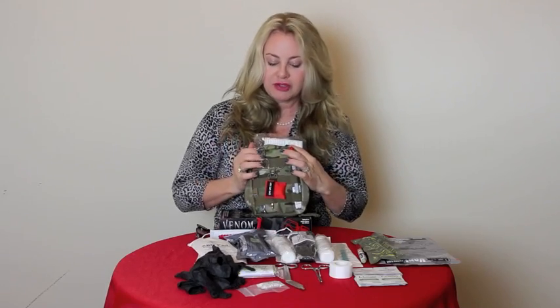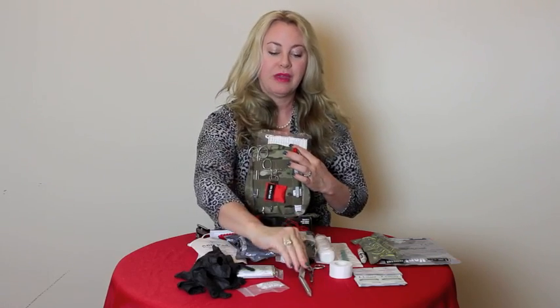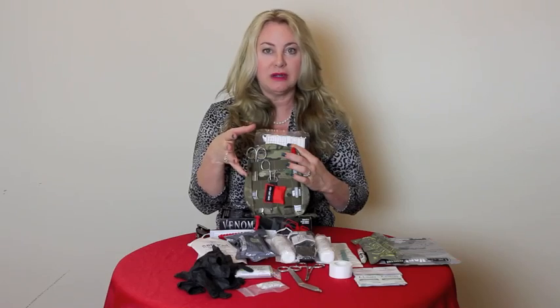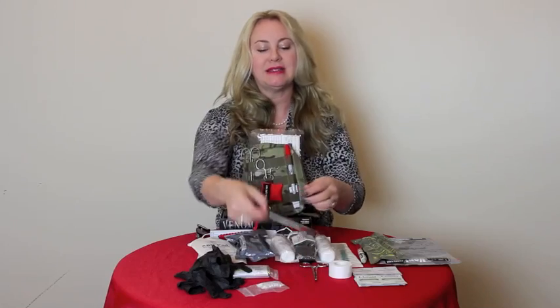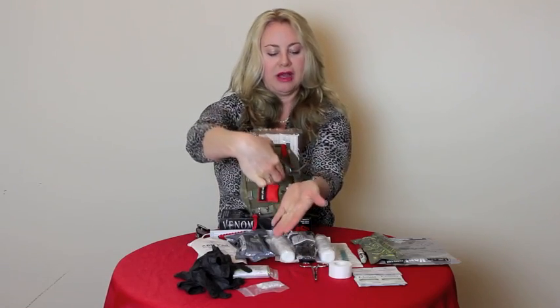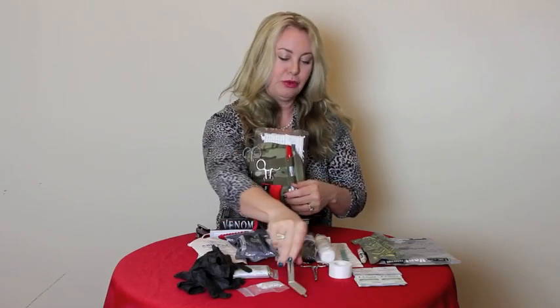Now, starting with the outside, we have instruments. We have a bandage scissors, which is awesome for cutting off the clothing. When you need to see a wound, the last thing you need is material in your way. So you can cut off jeans. It has a safety blunted edge right here so that you can go underneath jeans or shirts and not actually puncture the patient. Very important.